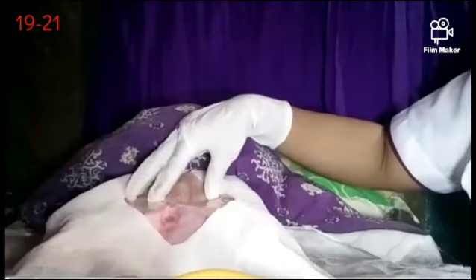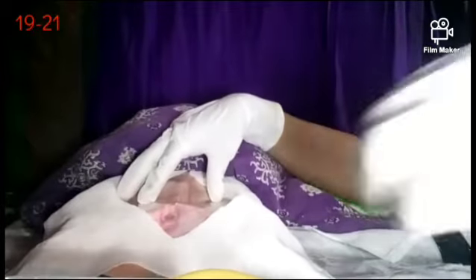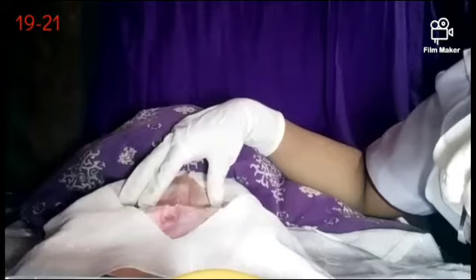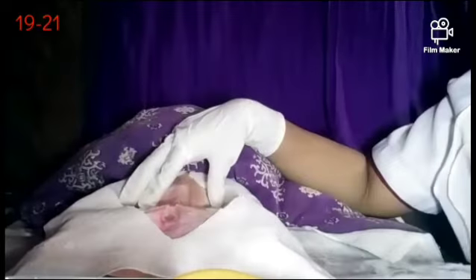Using the non-dominant hand, spread the labia and identify the urinary meatus. Maintain the hold until the catheter has been inserted with the dominant hand.